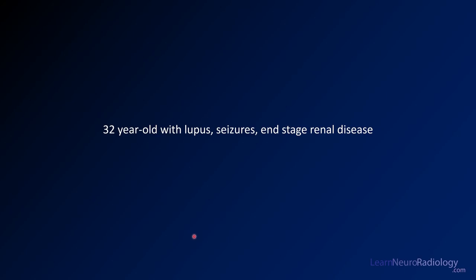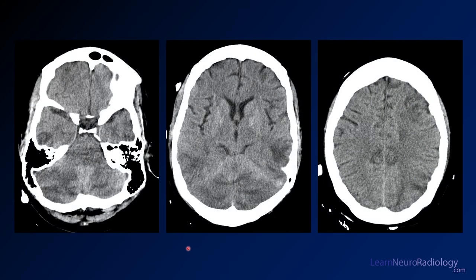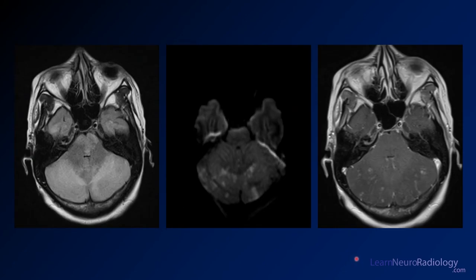Our next case is a 32-year-old with lupus, seizures, and end-stage renal disease. Here you see images from a CT. The CT isn't normal — you have areas of hypodensity in the temporal lobe. The cerebellum looks a little swollen, and you may not see the fourth ventricle well. Additionally, in the superior cerebellum, left temporal lobe, and maybe up in the left MCA distribution, there are patchy areas of abnormality. You want to go ahead and get an MRI to see what's truly going on.